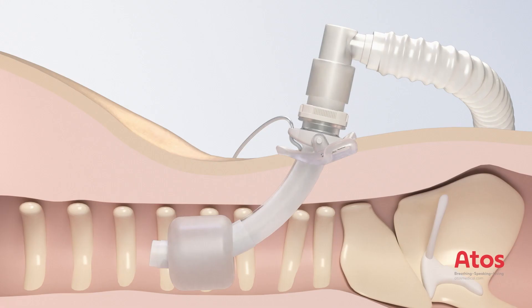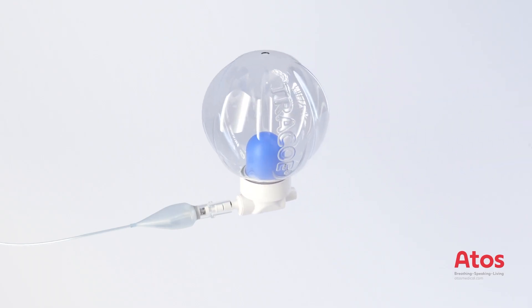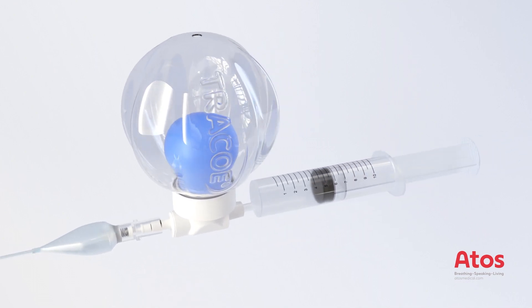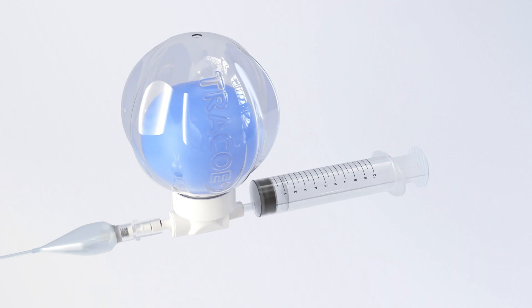The cuff pressure should be checked, for example with the aid of a handheld manometer. This should be between 20 and 30 cm of water. Alternatively, our Traco Smart Cuff Manager can be connected for continuous monitoring and regulation of the recommended cuff pressure.